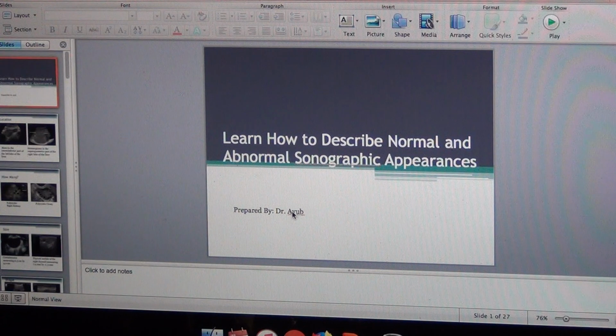Then one day, second day, third day, fourth day, by just looking at the organs you can say, oh, it's good looking or bad looking, and accordingly you can save a lot of time and produce a lot of quality images and diagnostic images, and your images will be high quality, optimum images, and nobody can argue with you.